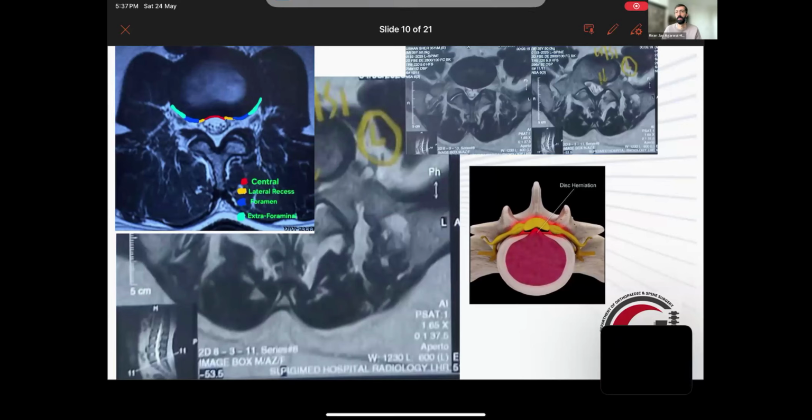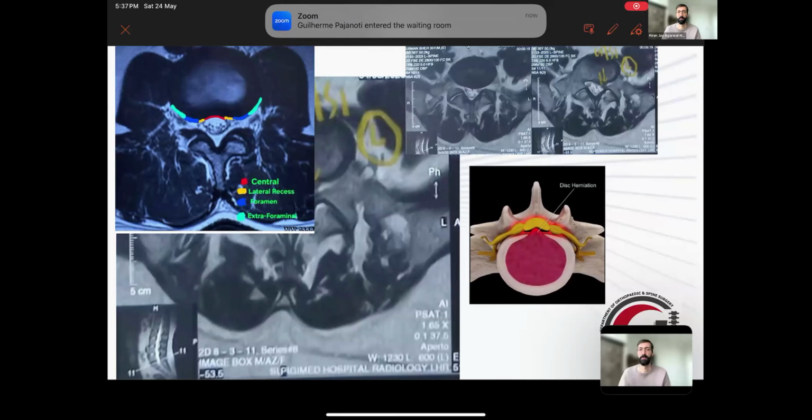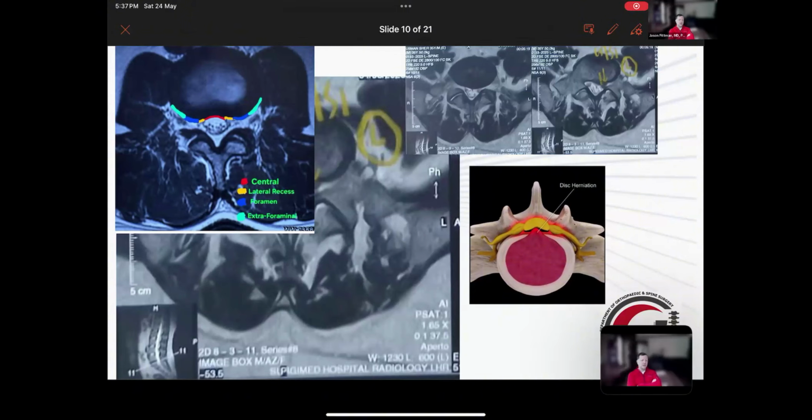And by that, Jason, you mean the confidence to be able to prevent bleeding that would need to be drained? Again, the beauty of the uniportal is you do very little bony work, so you don't have the bony bleeding like you do in the biportal. But every case I've ever done down a tube, I have never placed a drain. The reason for placing the drain in the biportal, in my mind, is again to deal with the irrigation fluid, not the postoperative bleeding.